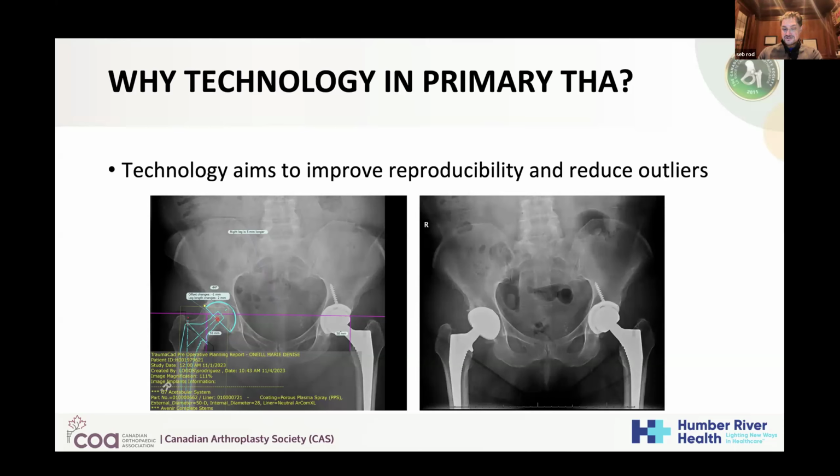And if you're just that good a surgeon that every single time you can do that manually, that is very good. But I think multiple papers have shown that as good as expert surgeons think they are, we're not always hitting the targets we want to hit.